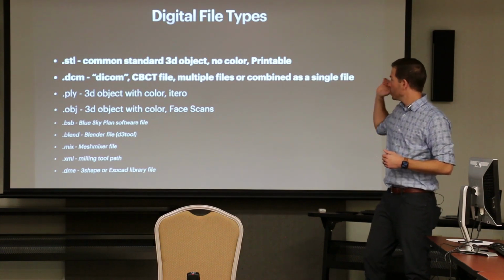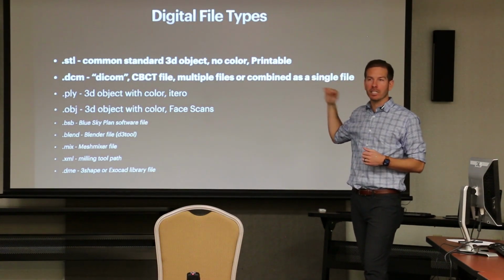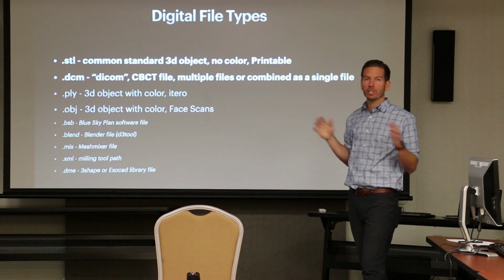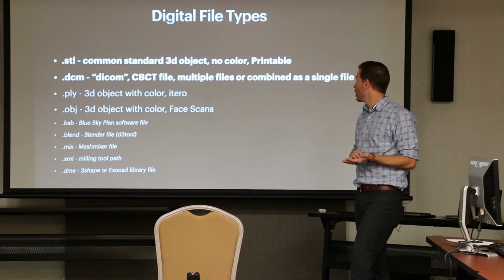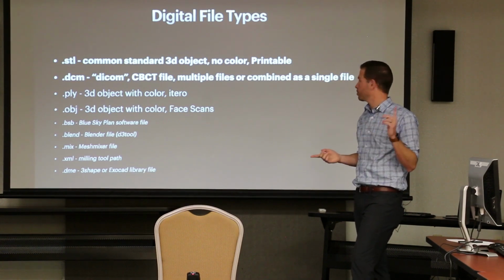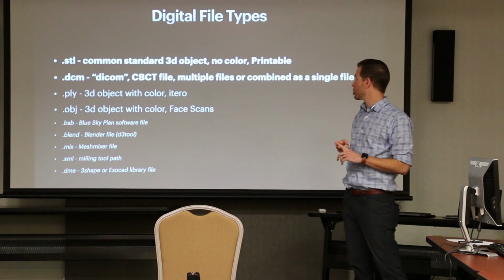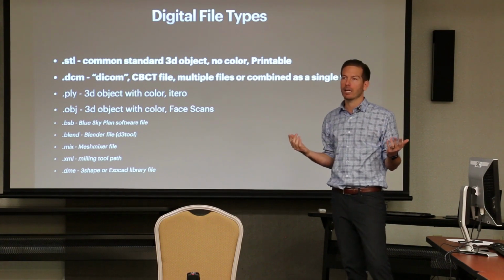So the two important file types that you need to know are STL and DICOM. Those are really the only two you have to understand in order to do this stuff. So your STL, it's just black and white. There's no color. It's printable. It's just a common standard 3D object. And so that's what the labs are using.